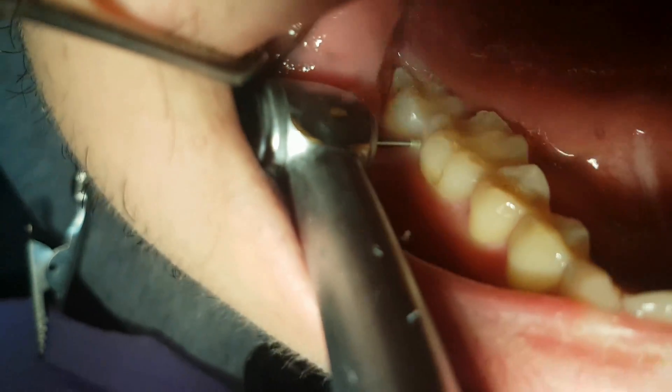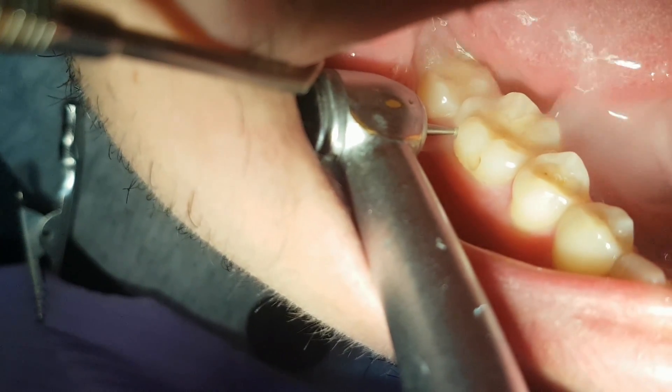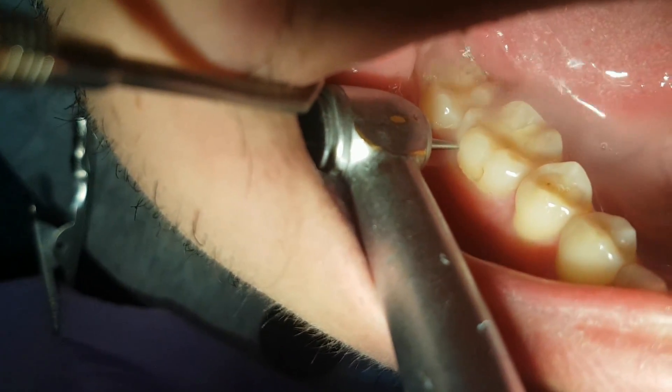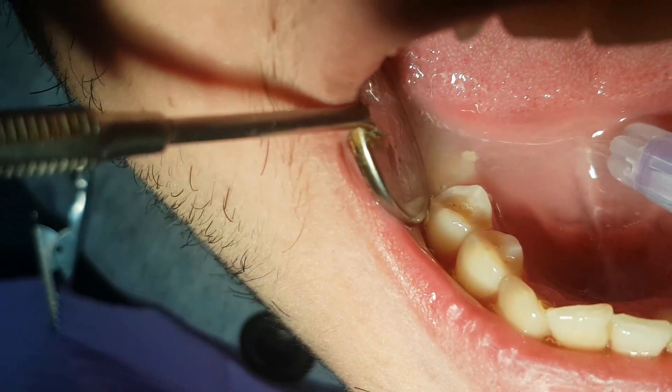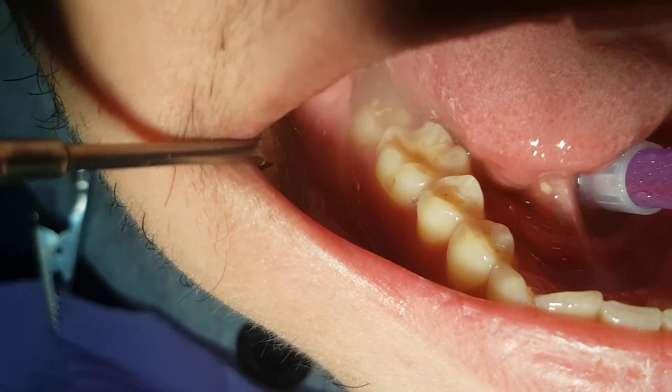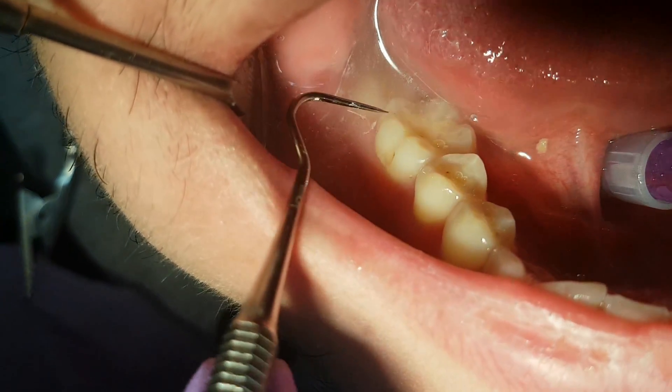Again we start with a dental turbine to open up the enamel. We do not use typical Black preparations because we use newer dental materials.